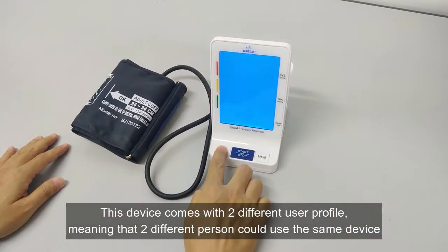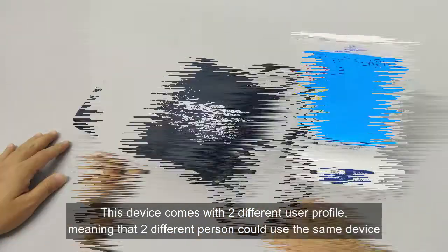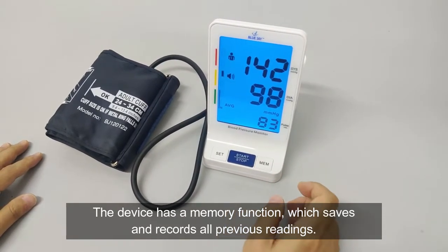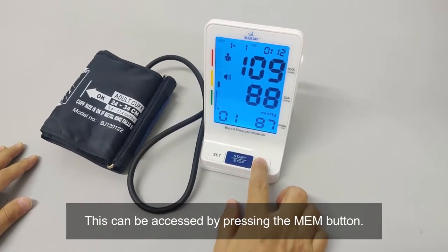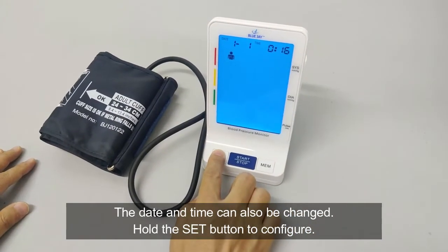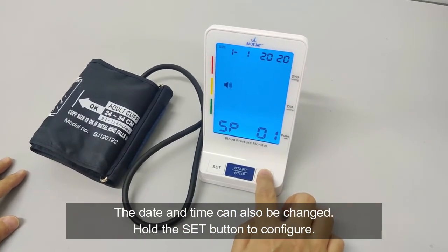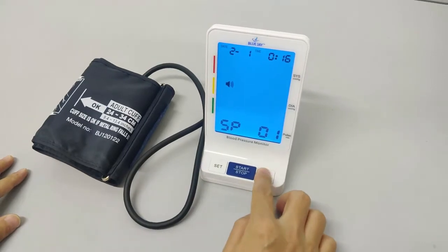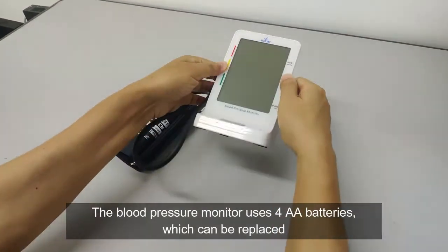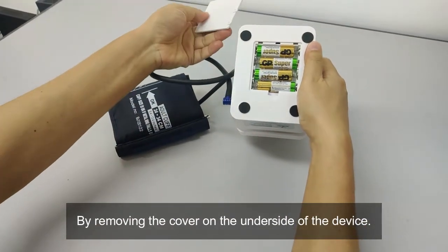This device comes with two different user profiles, meaning that two different persons could use the same device. The device has a memory function which saves and records all previous readings. This can be accessed by pressing the memory button. The date and time can also be changed — hold the set button to configure. The blood pressure monitor uses four AA batteries, which can be replaced by removing the cover on the underside of the device.